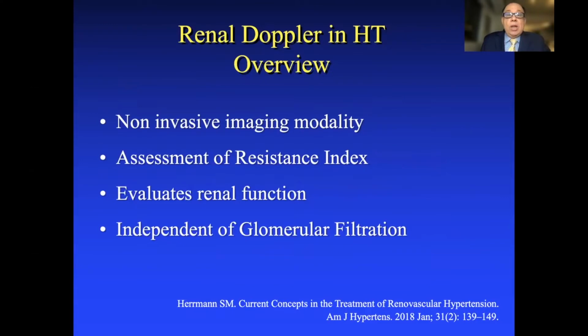So, renal Doppler is a non-invasive imaging modality which allows assessment of the resistance index. It can evaluate the renal function, and we can perform this study independent of the glomerular filtration.